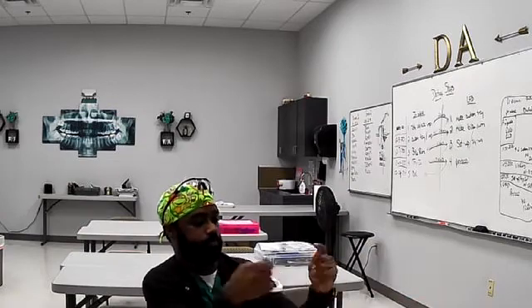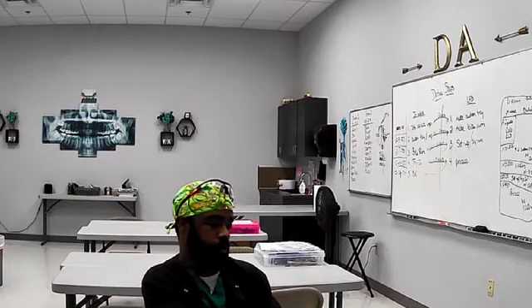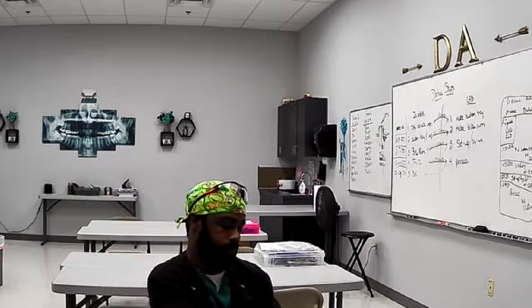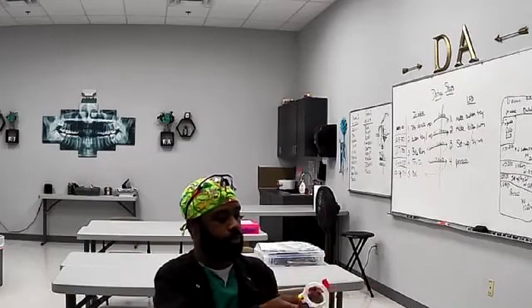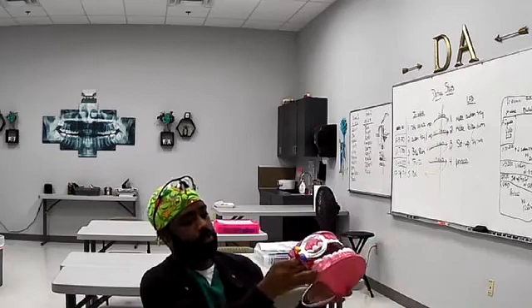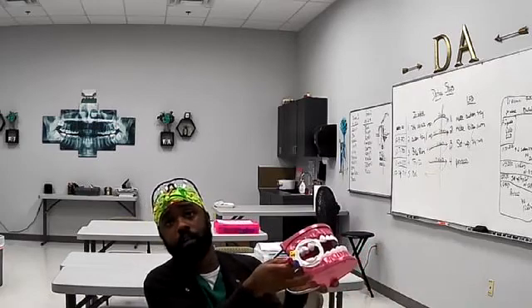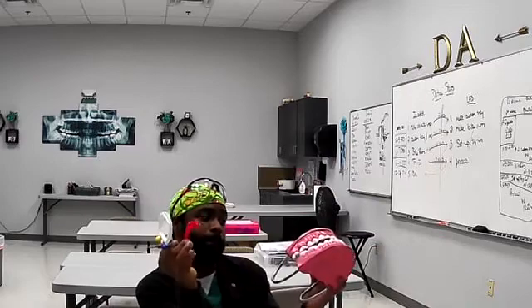So if you're taking your bitewings, you're automatically going to have your back posterior teeth, so those are out of the way.